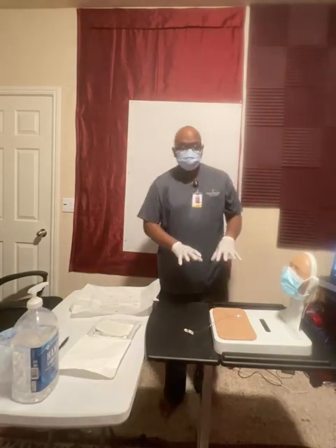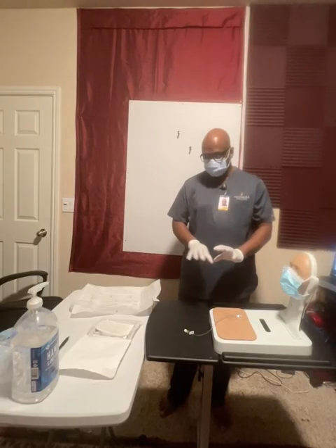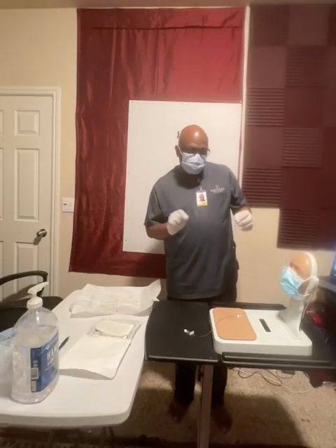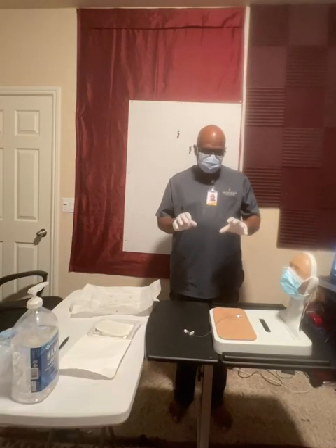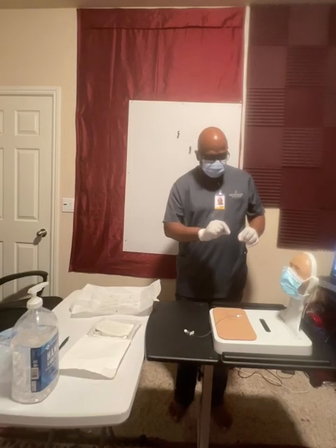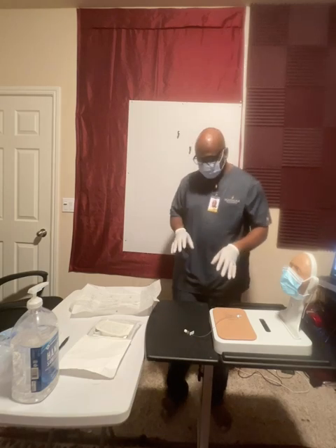Before we put anything on it, we want to let it dry. We want to make sure that the chlorhexidine solution has dried before we put on the new dressing. In the meantime, I just want to go over that if this had been an alcohol swab, cleaning with an alcohol swab is a little different. You're going to start from the center in a circular motion, working your way outward. With an alcohol swab, that's how you'll clean.